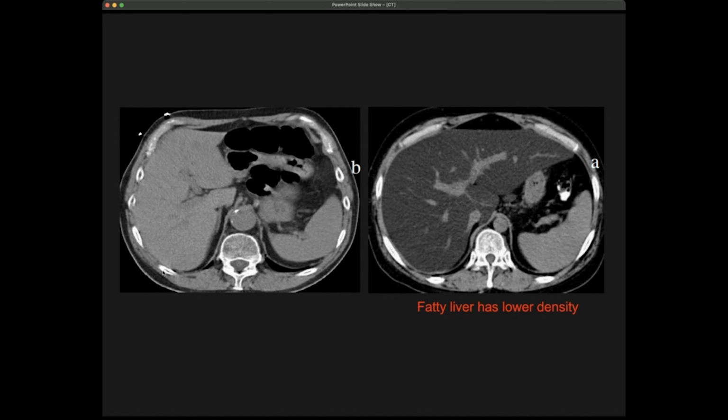So here, these white parts are of course still ribs that you cut through. And then you see this large homogeneous organ, that's the liver, and here you see air within the bowels. One of the things that you see is that the liver and muscle have very similar appearance, and that's what is normally the case.